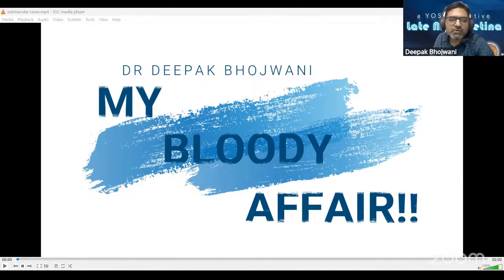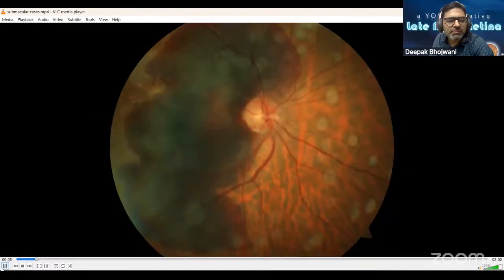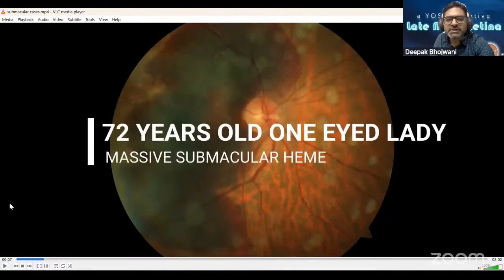I'll be sharing a few of my experiences with submacular hemorrhage. As we all know, submacular hemorrhages are not easy cases to handle. I'll share a few of my early experiences. This is one of the first cases in which I had experience with massive submacular hemorrhage, one of my earliest surgical interventions, which I'm going to share. So, case background: she is a one-eyed, aged lady with a massive submacular hemorrhage.